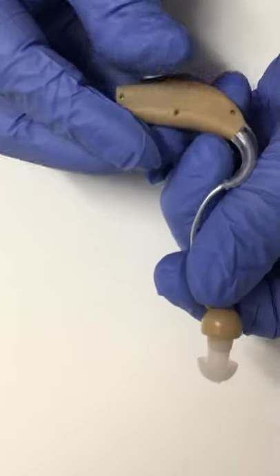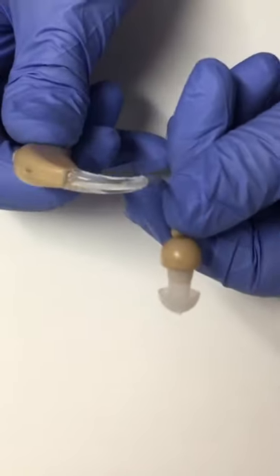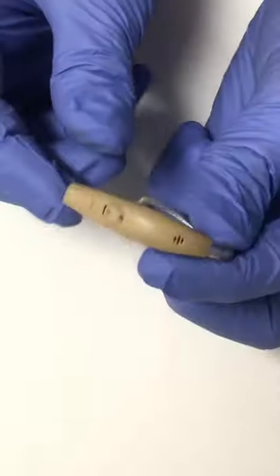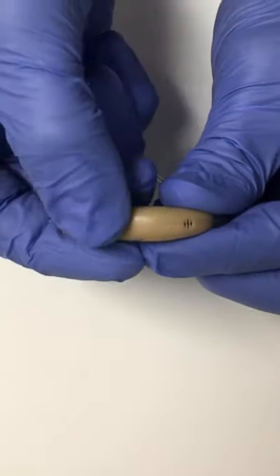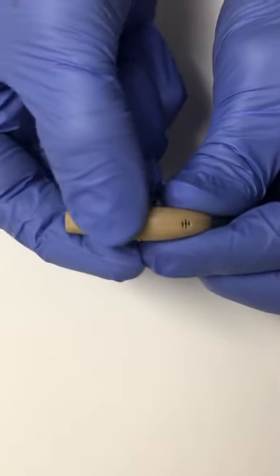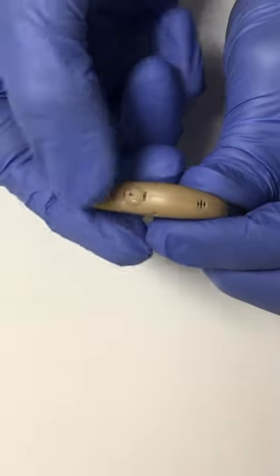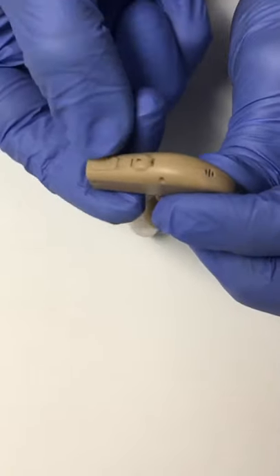Alright, this is a $20 hearing aid from CVS Pharmacy and it has a little volume wheel to adjust the volume here and then it has a button to change different settings.